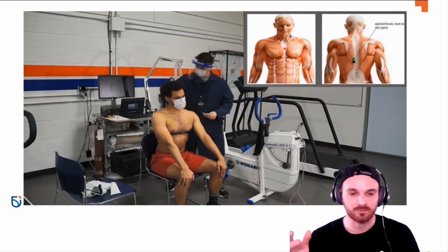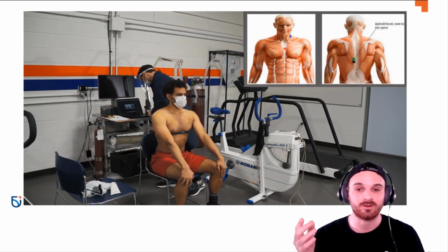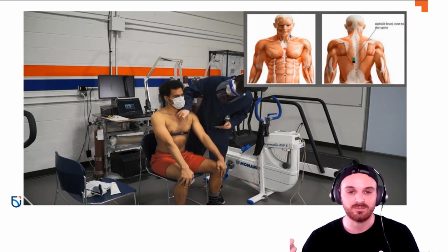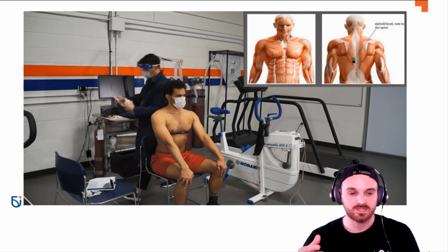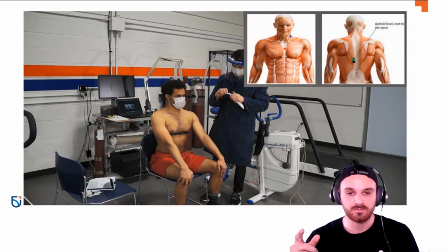Here I'm using our regular disposable 3 centimeter non-wet gel electrodes. So I did want to abrade the skin and make it quite well prepped. You can see that once that's dry, I'm going to apply a little bit of conductive gel on here. Again, because I'm not using the wet gel electrodes, I just want really good signal.